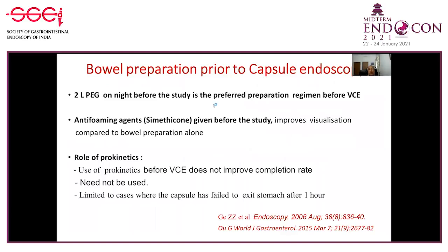The best preparation shown to date is 2 liters of polyethylene glycol preparation on the night before the study, and simethicone, an anti-foaming agent, given before the study is also helpful in better visualization. What about prokinetics? Is there any benefit in giving that?